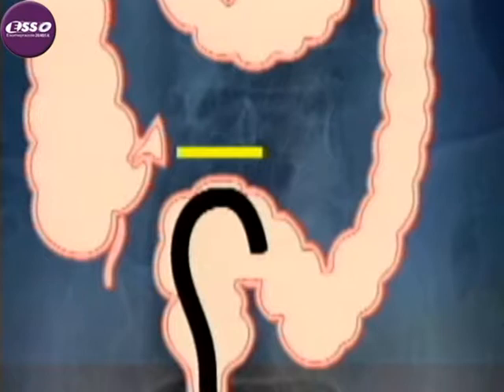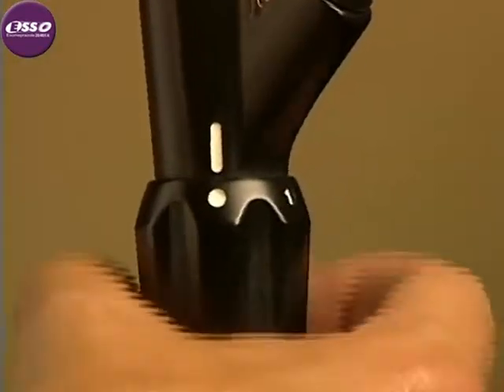is clearly in view. In this instance, it may be of value to switch to a thinner endoscope because the increased flexibility and reduction of force applied to the colon wall may allow the thinner instrument to be passed further without meeting fixed resistance. Having made these comments about the relative thickness and flexibility of the standard and pediatric insertion tubes, certain commercial colonoscopes are now available with a variable stiffness function.